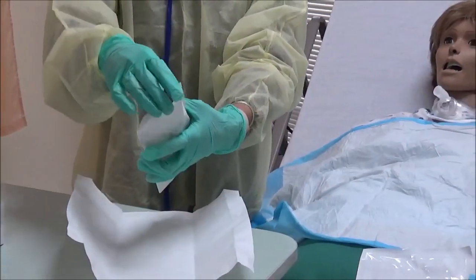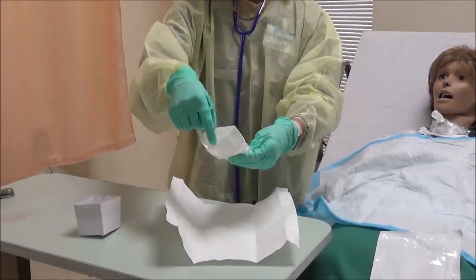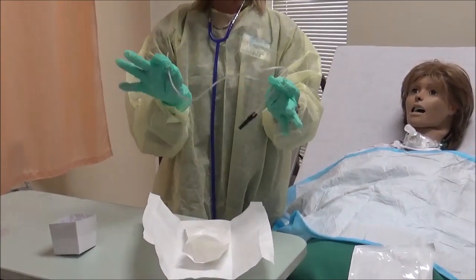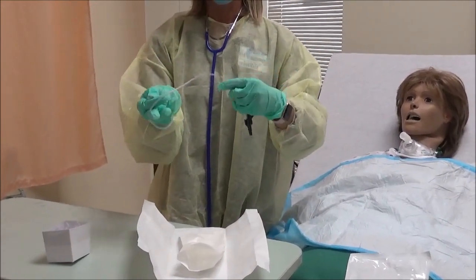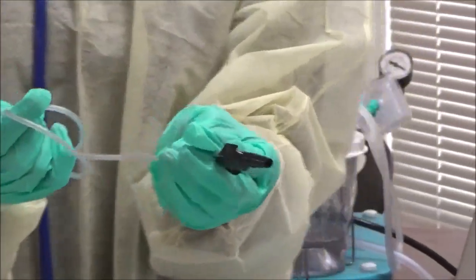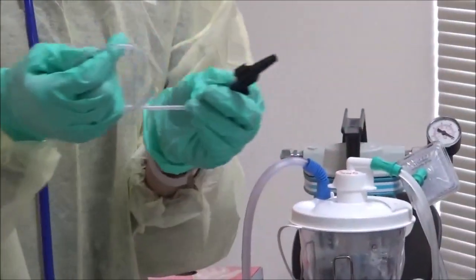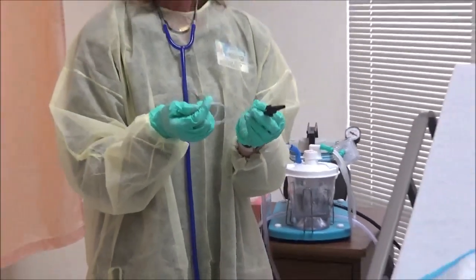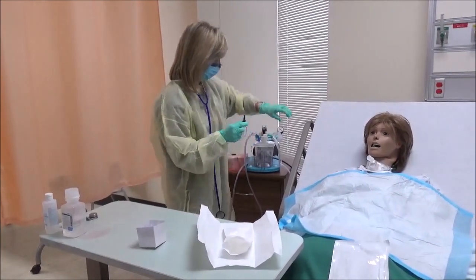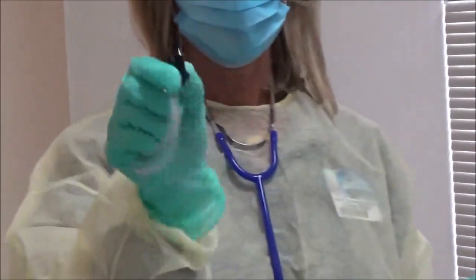Grab my suction catheter and come out with it. Remember the principles of sterile technique. Try to keep everything above the level of the waist. Sterile touching sterile. All of this is sterile. I'm going to kind of wrap this in my hand just because it's a loose, flexible catheter. And at this point, I'm going to connect my suction catheter to my suction tubing. So in this process, one hand is going to become contaminated. For me, that's going to be my left hand because I'm right hand dominant. So I'm going to grab the suction catheter. Remember, all of this is sterile right now because it's in this sterile hand.